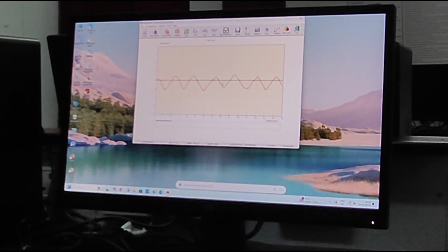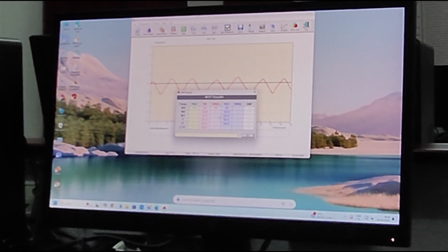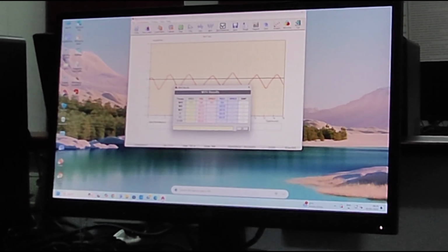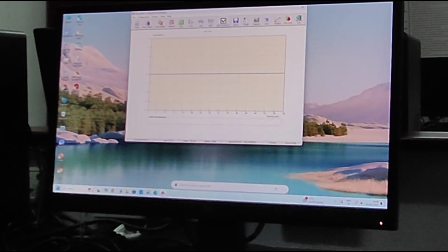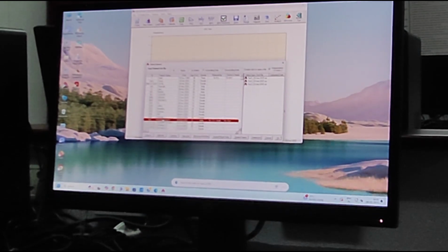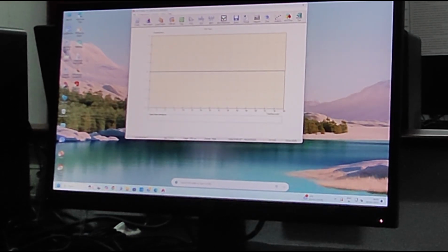After completion of each test, we can get the results through the results button. The MVV results are recorded here, and the SVC results too, by choosing the patient, we can get the data.